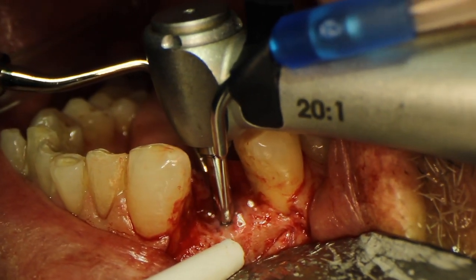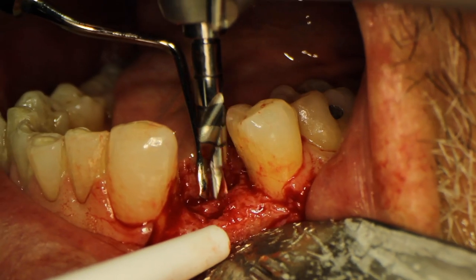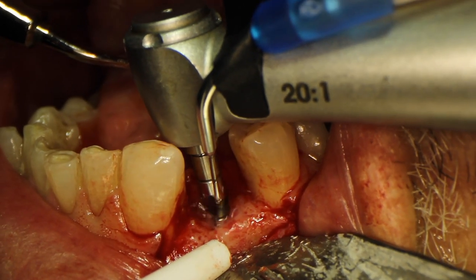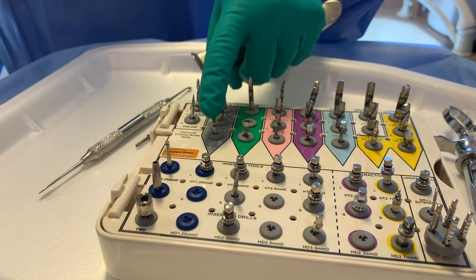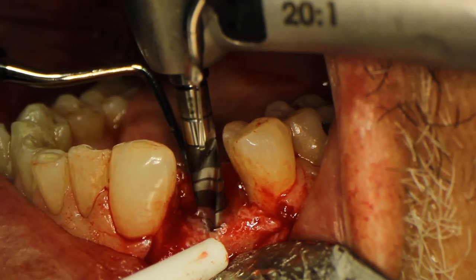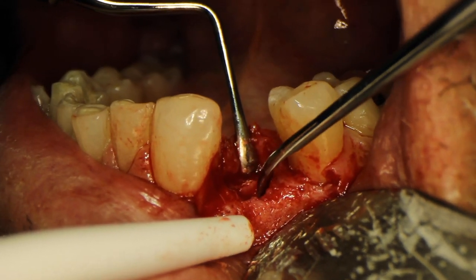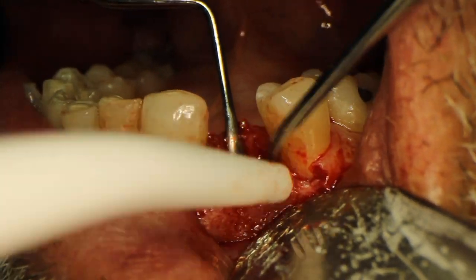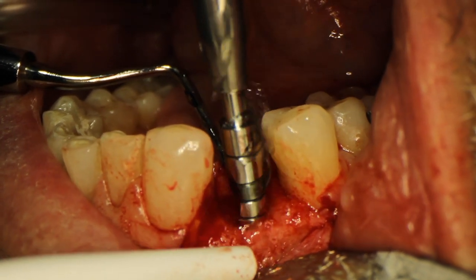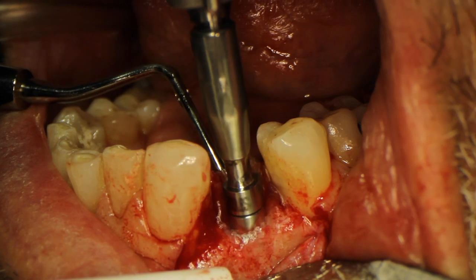I told you I always take x-rays after my pilot drill — this is the one instance where I'm not, because I can see that both of these roots are sort of divergent, and I feel really comfortable I'm not going to hit the roots. I'm going down sequentially with each drill, taking it down to 10mm — remember, you want to avoid that mental foramen and stay away from the nerve. I'm going down to 10mm with sequential drilling using saline cooling. Now I'm down to my last drill, and I'm scraping off that last little bit of fibrous tissue still there.